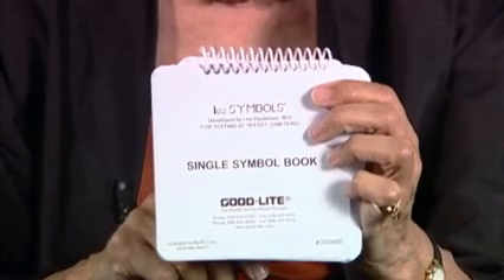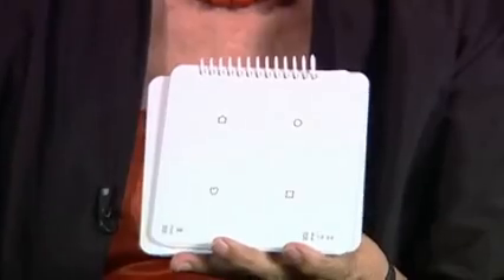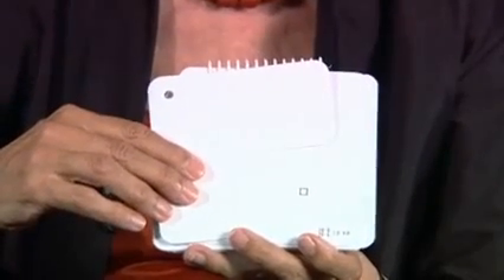The single symbol book is for measurement of single symbol acuity values, with a book where we can show single symbols on each page. When they become smaller, there are several of them on the page, but we cover the other ones and show just one at a time.